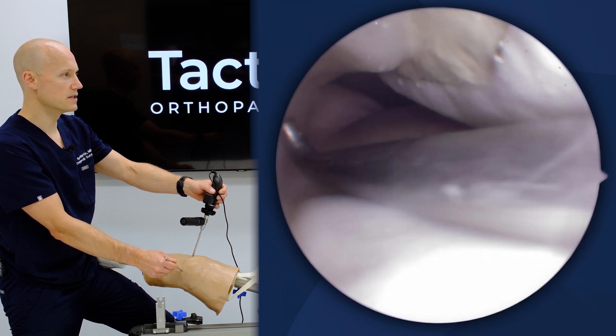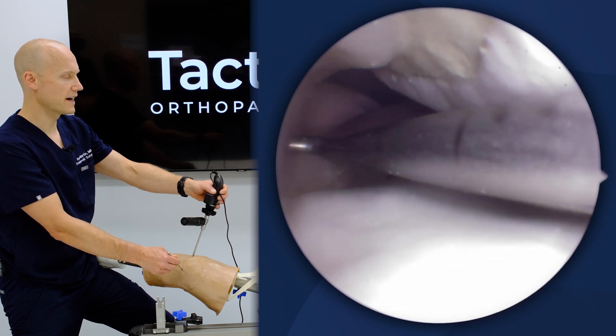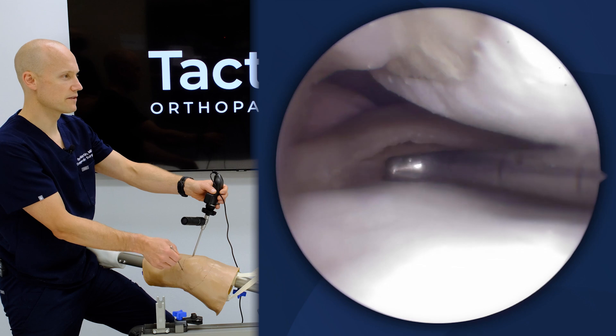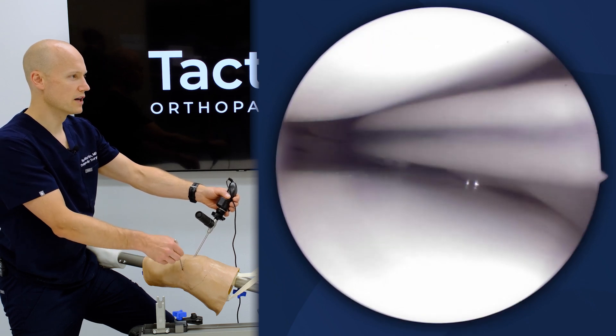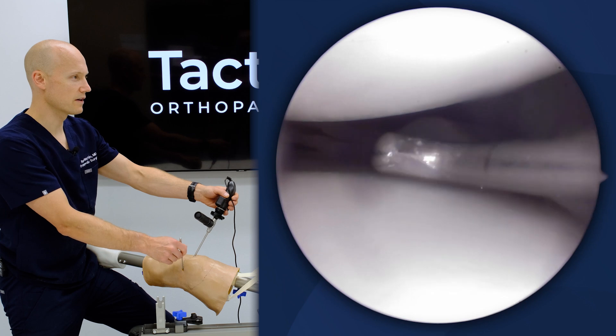You can see the PCL, which would be the posteromedial bundle of the PCL, and the aspects of it running down, and some of the septum in the back showing the different structures within this knee.